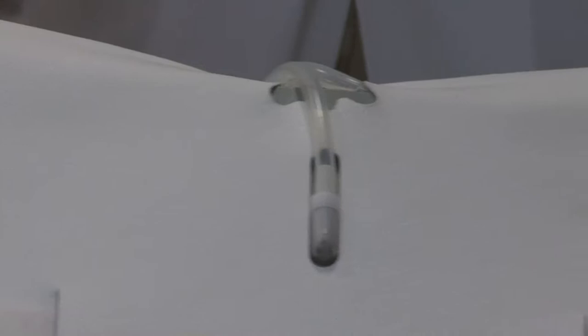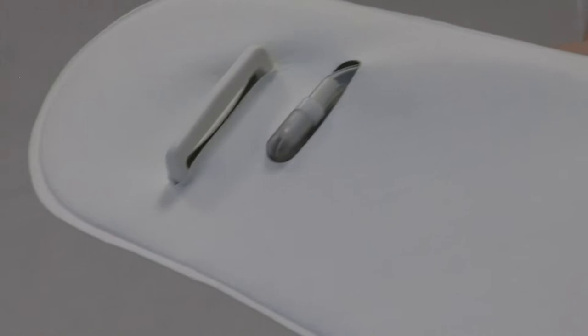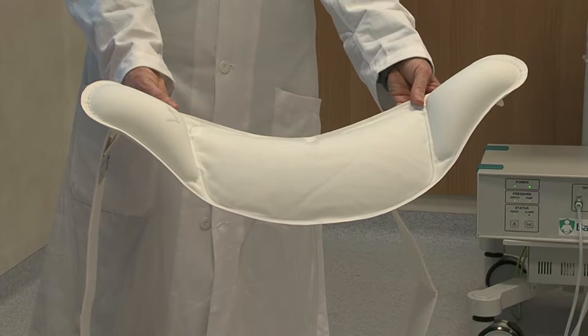Ogni sezione della fascia riceve aria separatamente tramite altrettanti tubicini: uno per la parte centrale, uno per la parte laterale destra, uno per la parte laterale sinistra, per permettere a discrezione del sanitario una diversa insufflazione di aria nelle tre camere per il corretto posizionamento del feto.